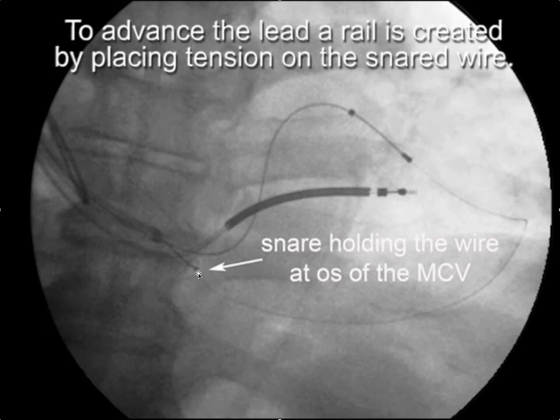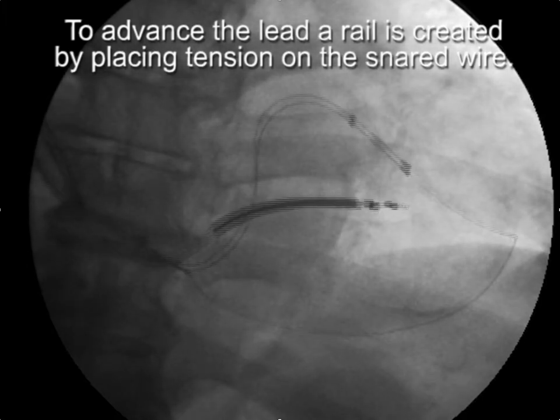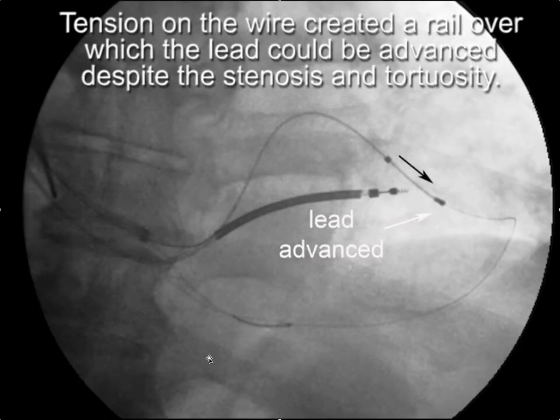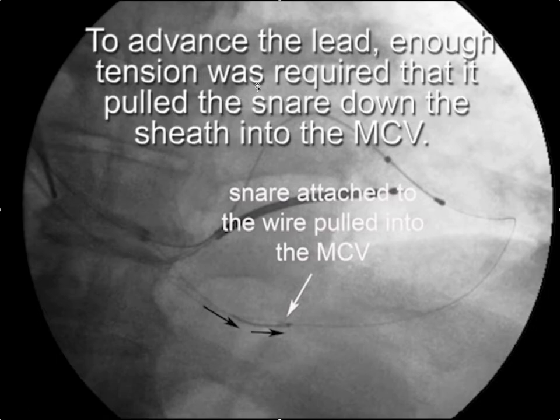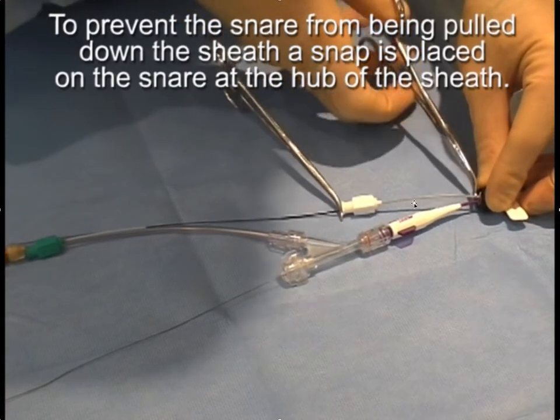Once the wire is snared, you can put traction on the wire and advance the pacing lead. When you do that, tension on the snare tends to pull the snare in the direction of traction. As seen here, advancing the pacing lead pulls the snare down into the middle cardiac vein, which causes you to lose stability and the ability to create tension. To prevent this, once everything is positioned and before putting traction on the wire, place a second hemostat right at the hub.